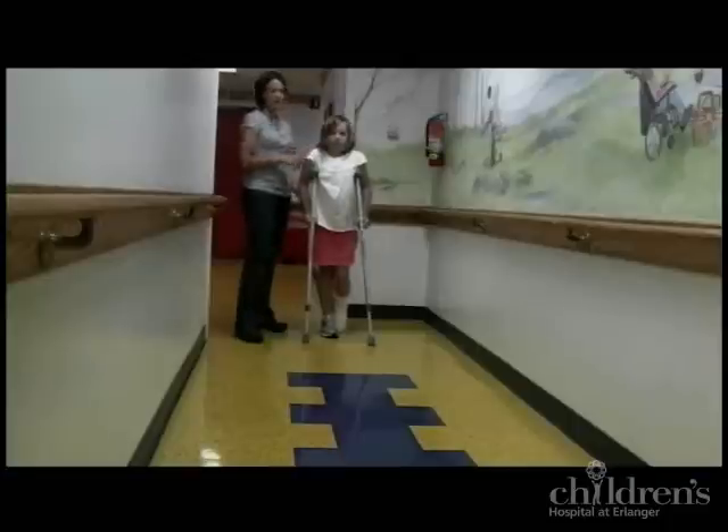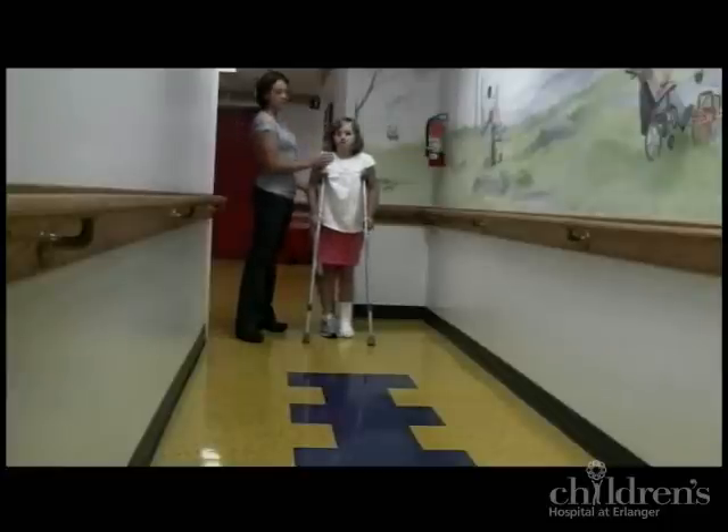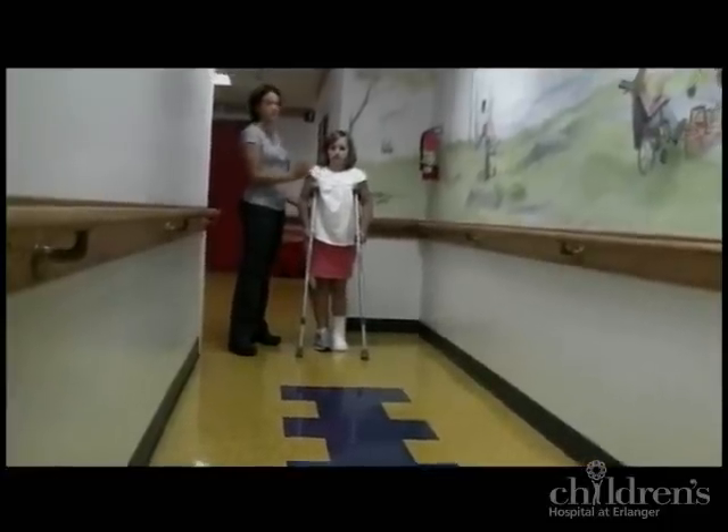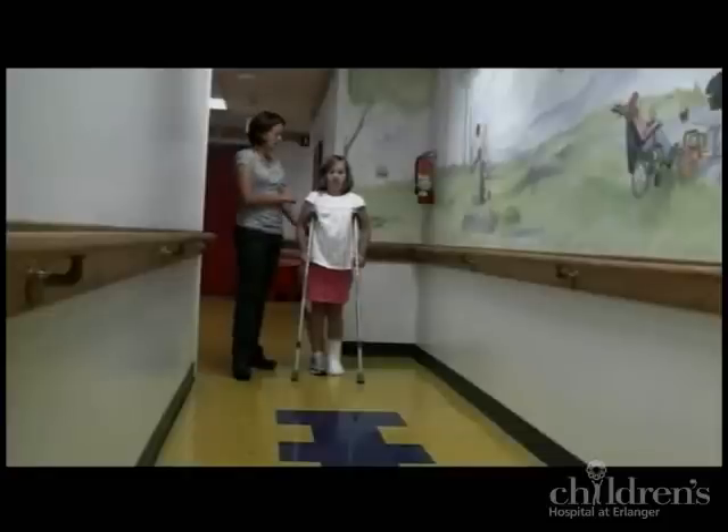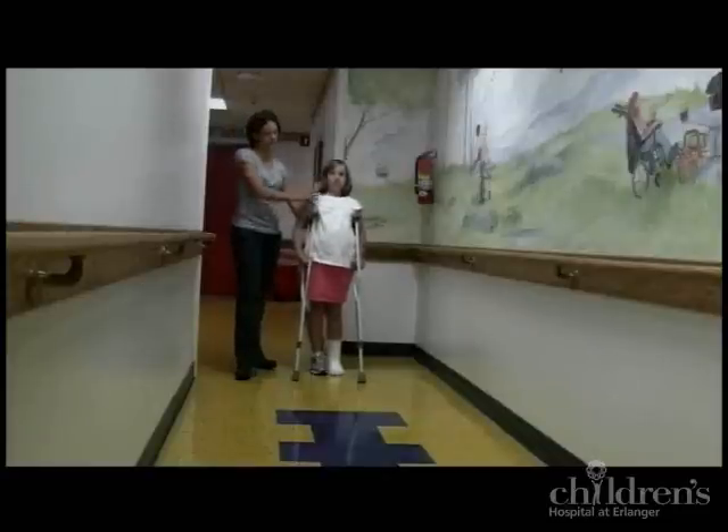The right way to guard your child if they're a little unsteady with their crutches is to have one hand on the shoulder. If they start to tilt a little bit, especially forward, you can give a little steadying push to their shoulder — not too much because you don't want them to fall backward. Another good thing to do is put your hand on their waistband so that if they were to fall backwards you can correct them forward, with your other hand on their shoulder to keep them steady and upright.